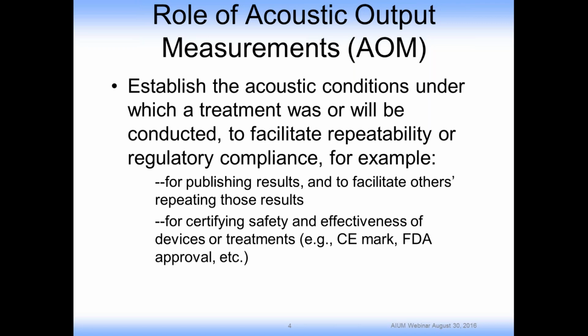Also, another usage is for certifying safety and effectiveness of devices or treatments. For example, for purposes of getting a CE mark or FDA approval, acoustic output measurements are a part of those processes.